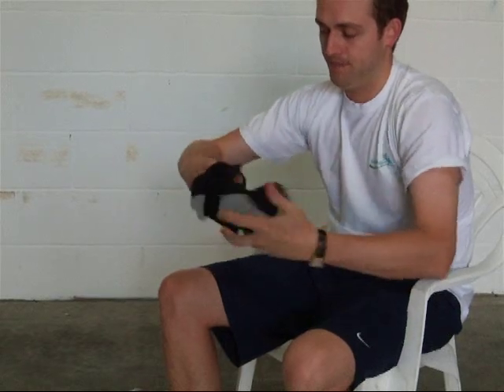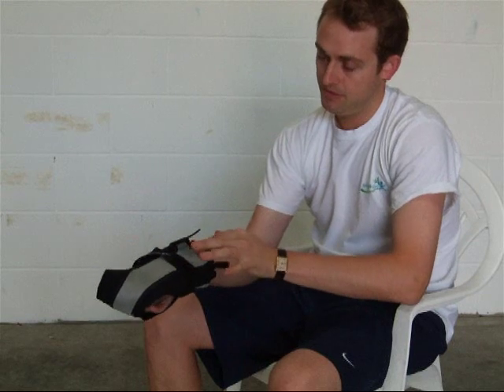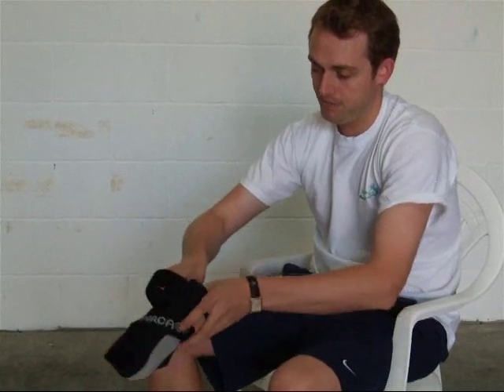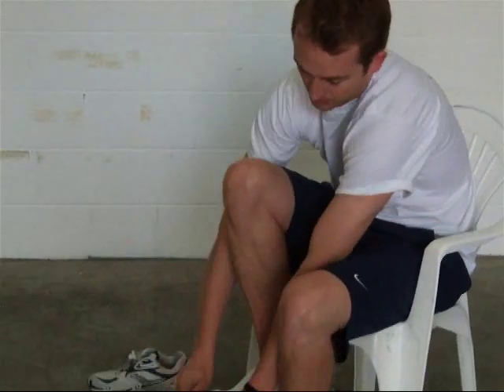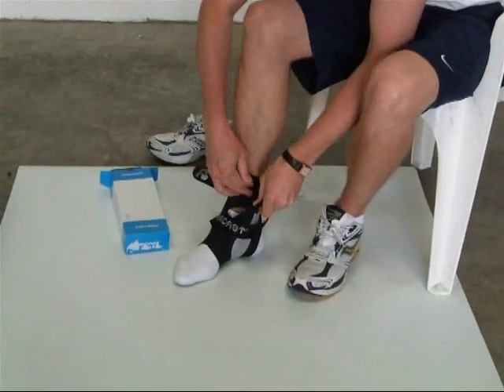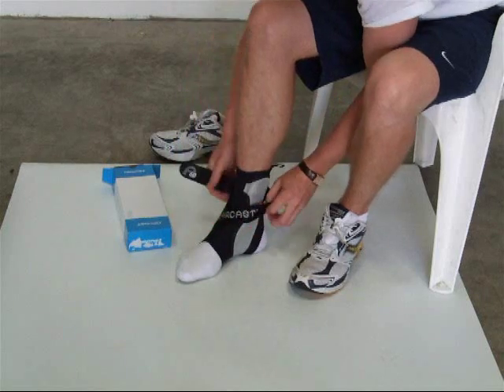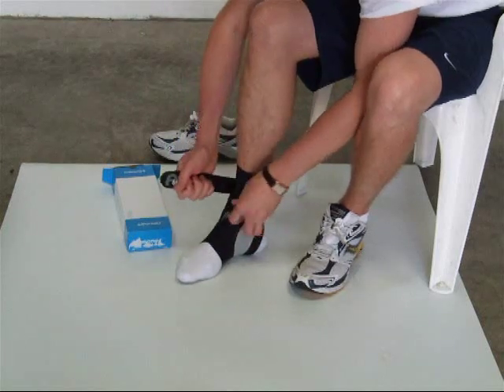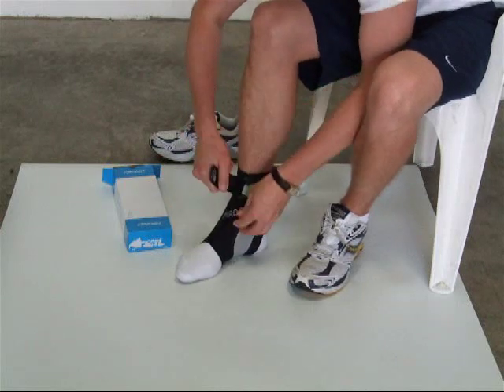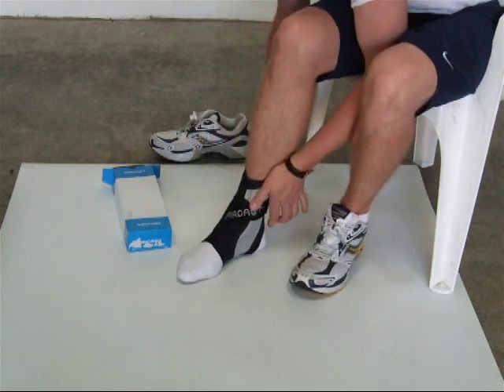It has a rigid splint down either side that fits round your ankle and you simply pop your foot in, do it up with Velcro and then just pull the strap in tight, thread it through and then Velcro it back up again.